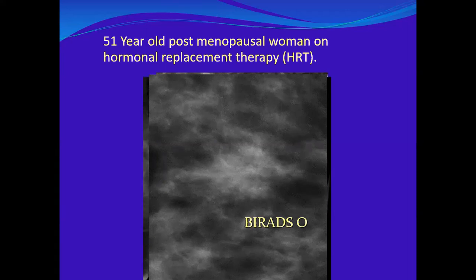It would be a focal glandular tissue. You mean an island of parenchymal tissue, but there is distortion. Why is it distorted and why is it calcified? So there is pathology here, but this pathology can be benign, it can be malignant.